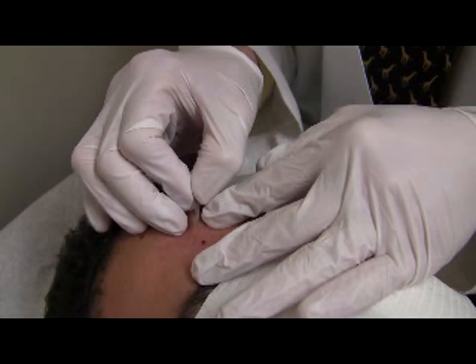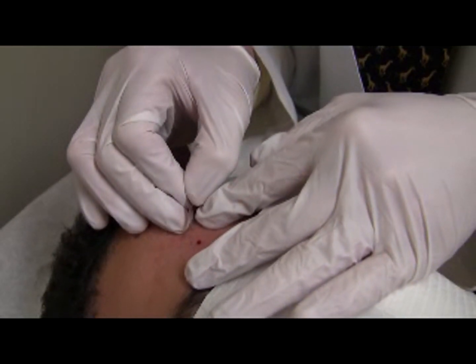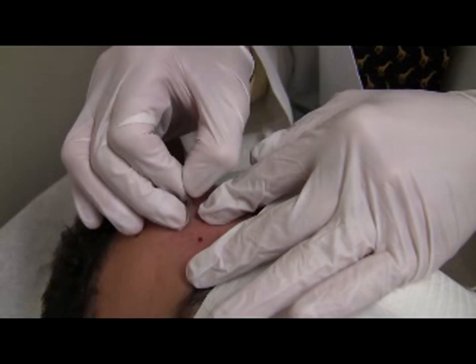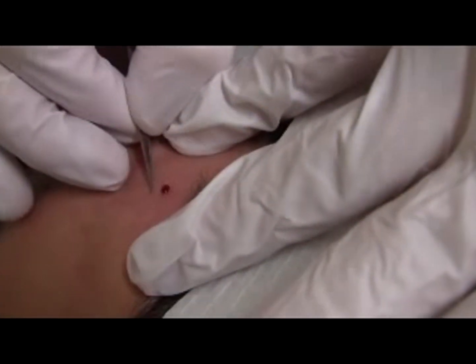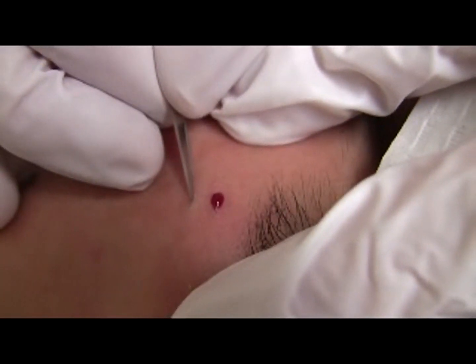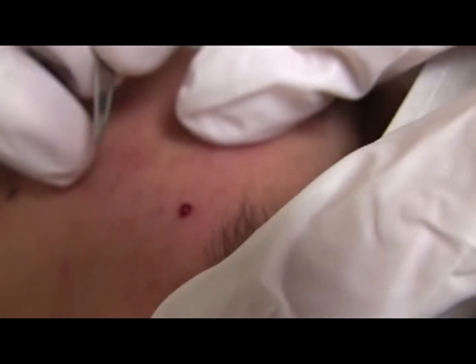This allows for friction between the index and third finger, thereby giving a controlled displacement of the 11 blade. When at the center of the lesion, pull the 11 blade directly up, perpendicular to the skin. I'm going to move in towards the center and now up. Once the slit is made in the lesion, there is a path for egress of lesion contents under pressure.